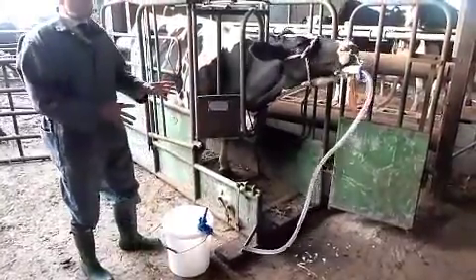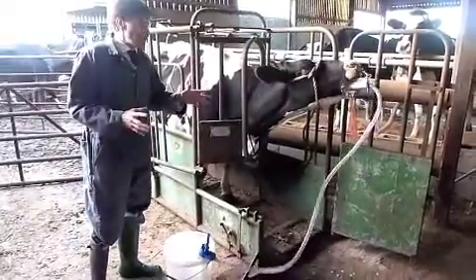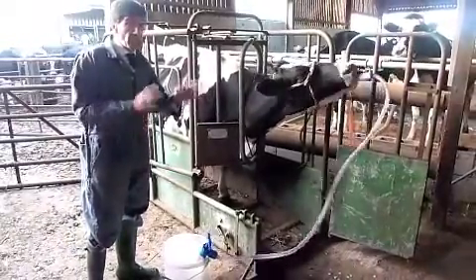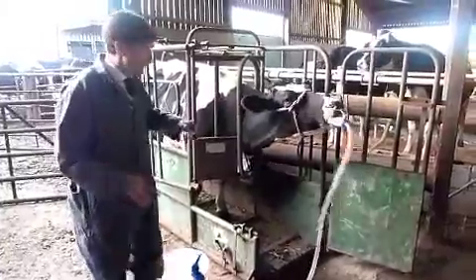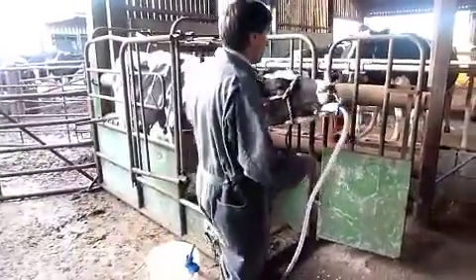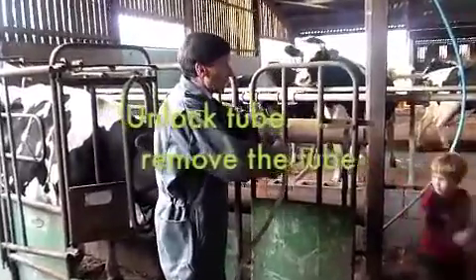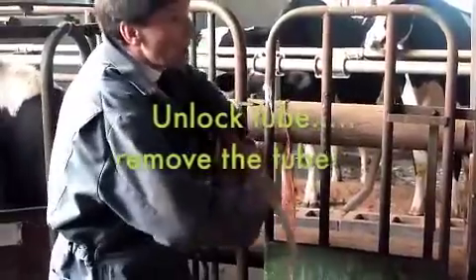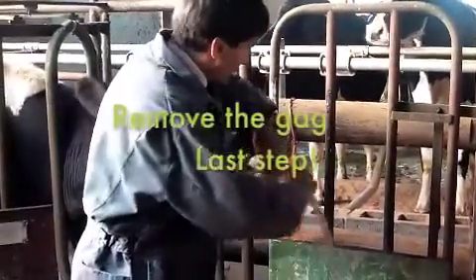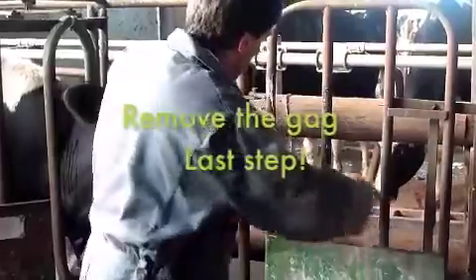So we've got 20 litres into her now, which is enough to make a difference. When we come to talk about what we're trying to do, you'll see that it's not perhaps always as much as we'd want, but it's certainly the minimum that's going to be useful. The next step is to unlock the hose and the gag and draw the hose out so that she doesn't bite it as you take the gag out. The hose is now drawn out, we can take the gag out, and the job's done.